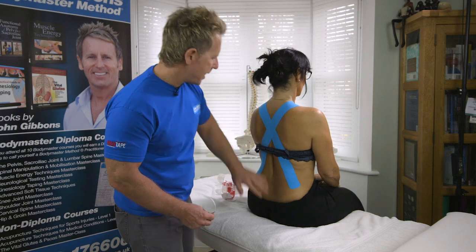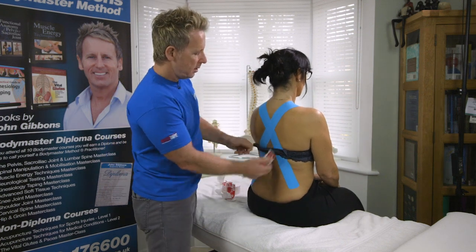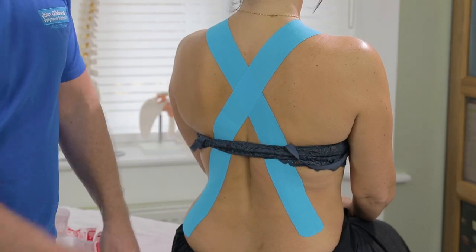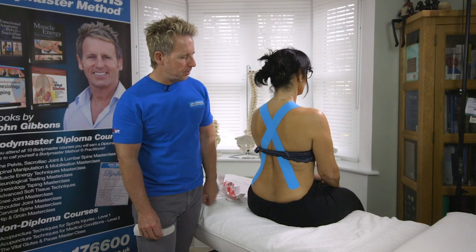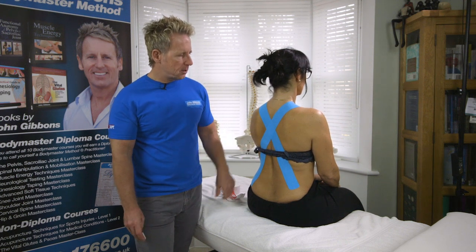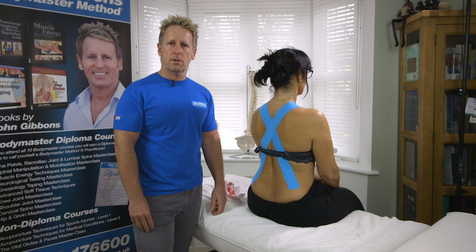There's almost like a diagonal sort of tape in. You might find the bra strap a little awkward but in reality patients will come in with a bra strap, so you have to adapt accordingly. I hope you like the video — this is applying K-tape for postural taping.